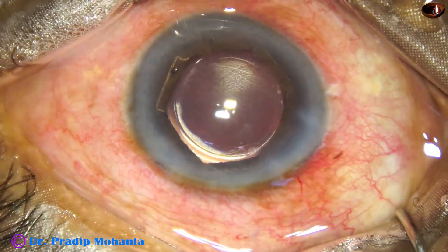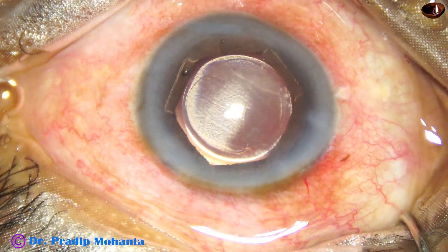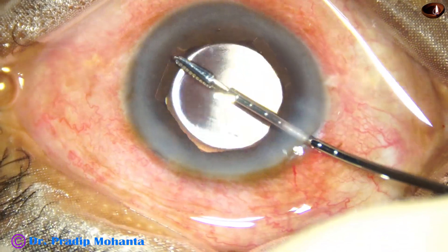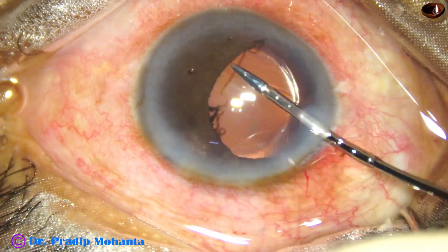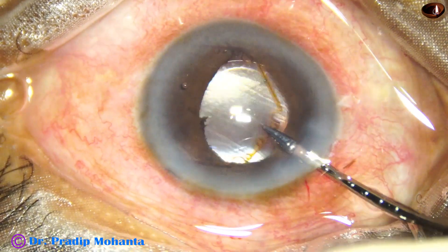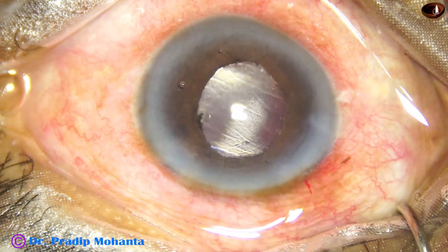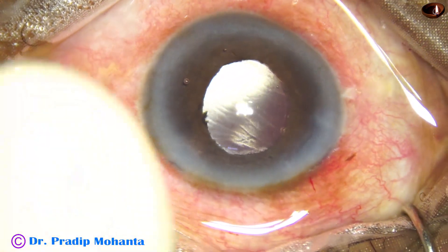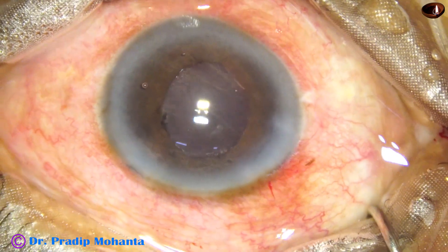I have seen some colleagues implant the intraocular lens under the whole nucleus — I have also done that once or twice — but we can safely emulsify half of the nucleus and then implant the intraocular lens.